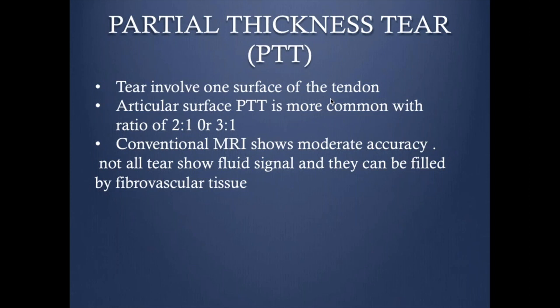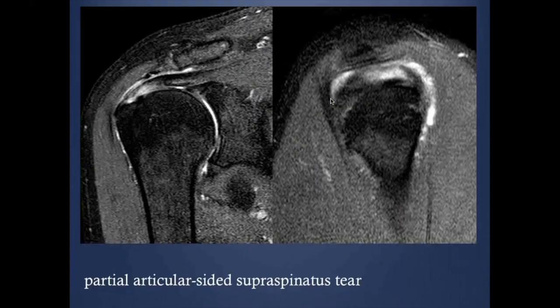Nevertheless, in our practice, for most rotator cuff disease we perform conventional shoulder MRI initially. Some institutions may consider arthrogram for articular surface partial thickness tear. As you see here, there is a fluid signal intensity involving the articular surface of the distal supraspinatus tendon, with the bursal surface still intact — an example of a partial thickness tear at the supraspinatus.